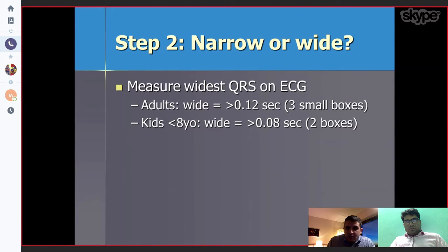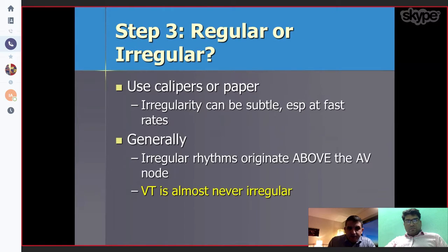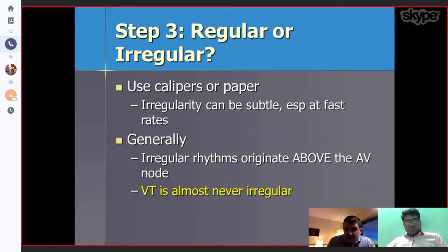Is the QRS narrow or wide? In adults we define wide as more than 120 milliseconds, and in kids more than 80 milliseconds. Is it regular or irregular? Sometimes it can appear irregular but not always, so use a caliper or paper. Irregular rhythms typically originate above the AV node, but in some cases when the rate gets faster it can also appear irregular.